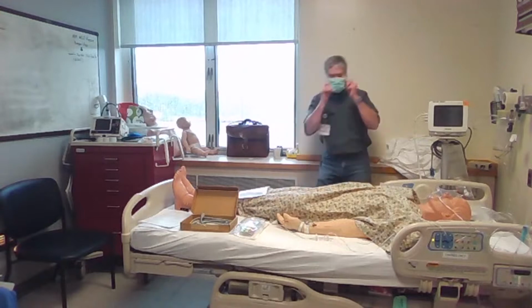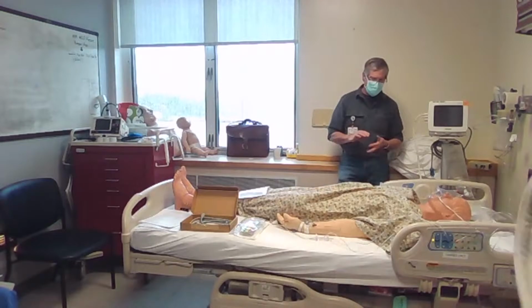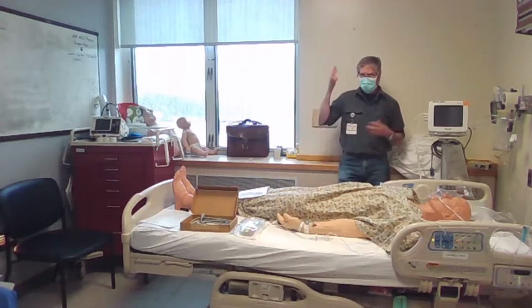Alrighty, well, here we go. Start from the top, the indications. So cardiopulmonary bypass is an indication for A-lines, when you expect wide swings in blood pressure. A lot of times we will put them in for spine surgery because those patients are in very long surgeries. Their blood pressure tends to go up and down. Sometimes they have a whole lot of blood loss.